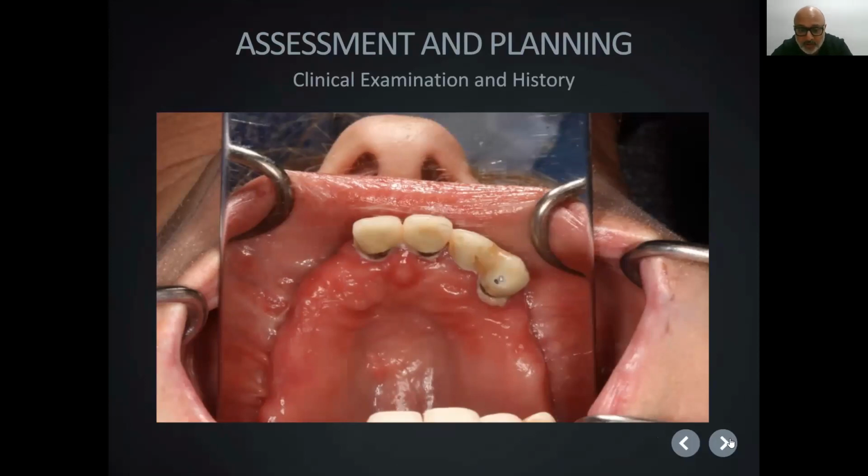She probably wears the denture at night because there are early signs of denture stomatitis, and some denture stripping and rubbing. Those anterior teeth, other than radiographically, you can also physically see that they have a fairly poor prognosis. They've splintered together, probably because they were moving.